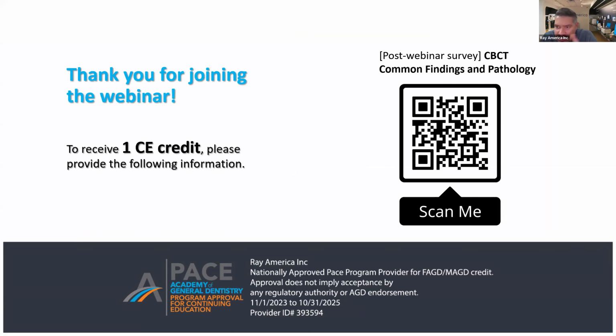Okay. Now, doctor, I did see one question here, which I like. If we need to follow up on a finding, how long after do we wait to take another CBCT scan? Yeah, so typically follow-up CBCT scans are going to be anywhere from 6 to 12 months, just depending on what we're concerned about. If it's something that's potentially very benign, we'll push it more towards 12 months. If it's something that might be a little bit more concerning, like some kind of aggressive lesion or recurrency, something like that, we'll look more towards 6 months.